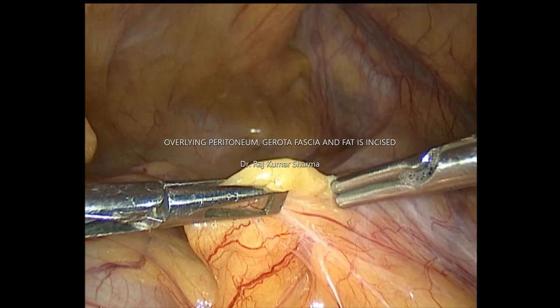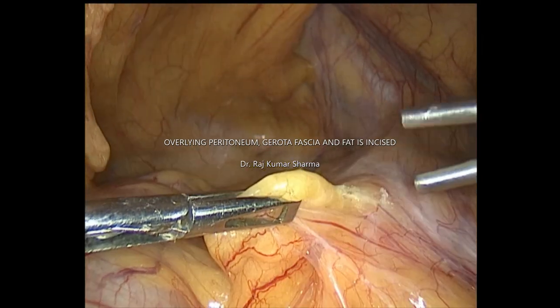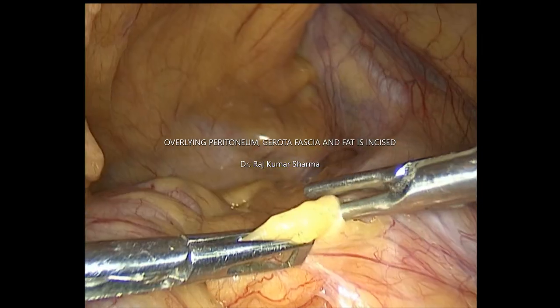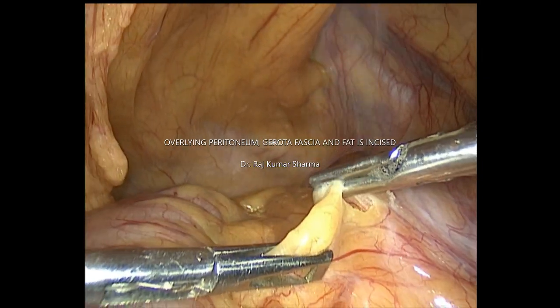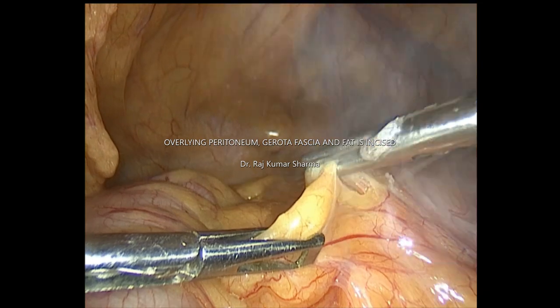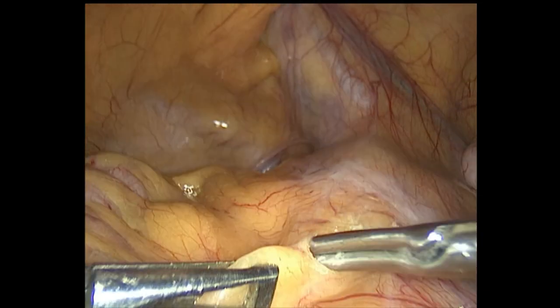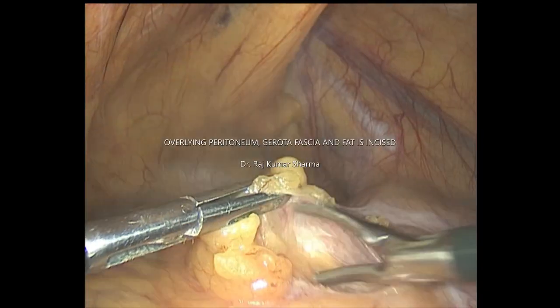You can use harmonic, bipolar, or monopolar to remove the overlying peritoneum, fat, and fascia.